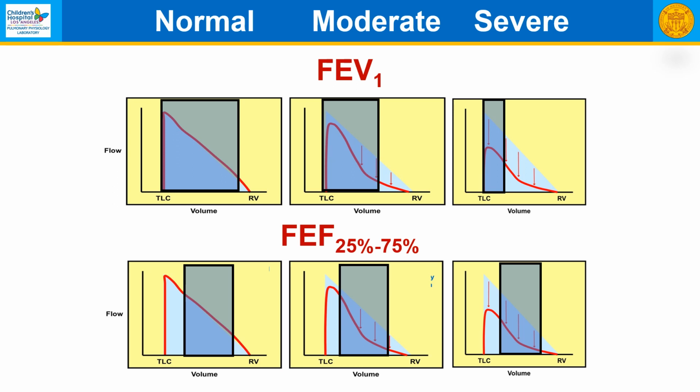So you will often see in someone with obstructive disease that they may have an FEV1 of, let's say, 60% predicted. The FEF 25-75 might be 45% predicted. The reason, at least in part, is that as you get more airway obstruction, the FEV1 reflects mostly large airways, whereas the FEF 25-75 always reflects the middle-sized airways, or the middle part of that curve.